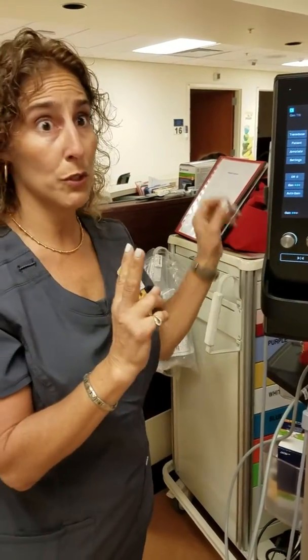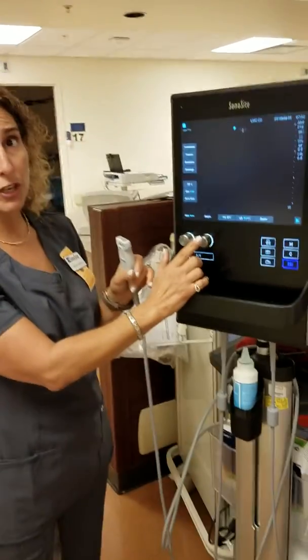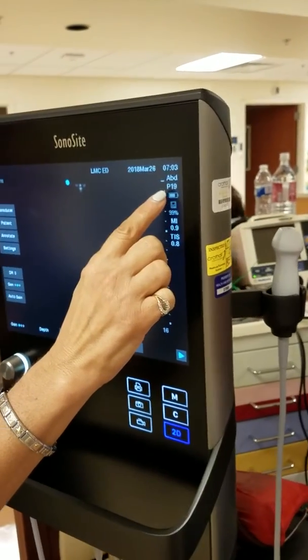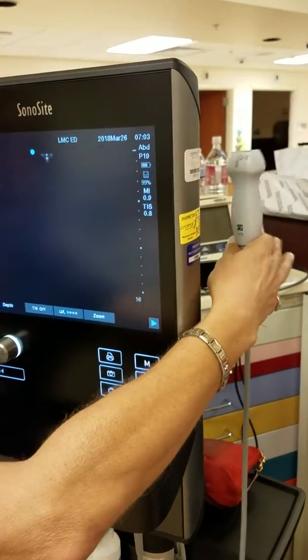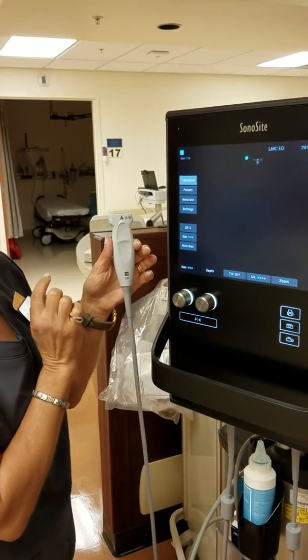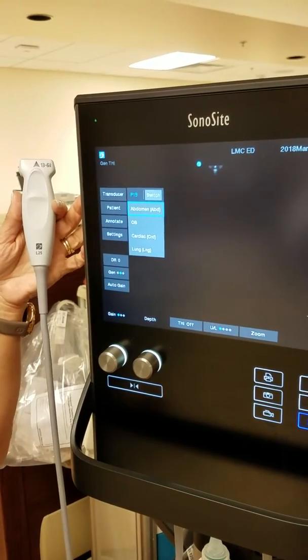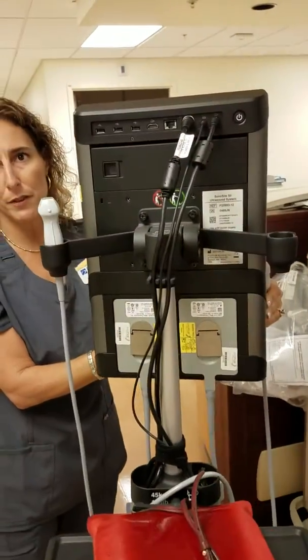Your two most important buttons, once you turn the transducer on, are going to be your gains and your depth. In order to change your transducer, look up here to see which transducer is on. Right now it's showing the abdominal mode on the P, which is the phased transducer. So if we want to do vascular access, go to where it says transducer, tap on it, and switch it to the linear L25 and hit switch. It automatically switches — it has two probes plugged in, so you do not have to unplug anything.